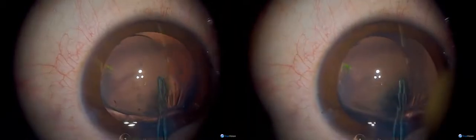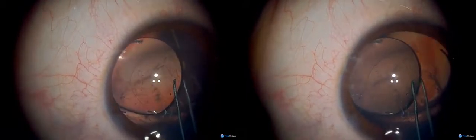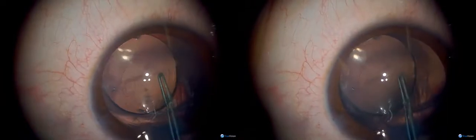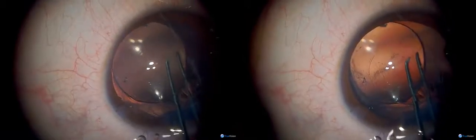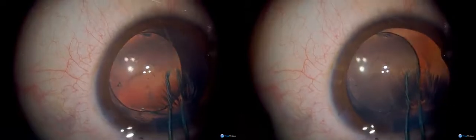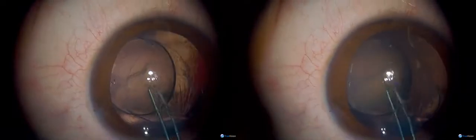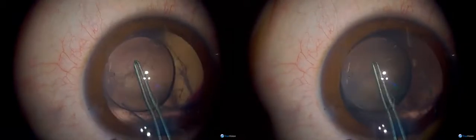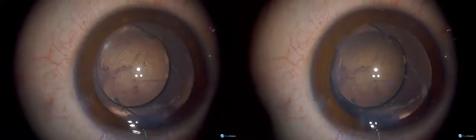So you're trying to remove the membrane under the IOL? Yes — I think this is the posterior capsule. I was going to do a primary posterior capsular rhexis, but he already has a hole in the capsule so I'm just making it bigger. Why not just leave the posterior capsular membrane and do a YAG laser later? You could — but if you leave the posterior capsule it will opacify at this age in all patients. If he's able to cooperate at the laser you could do that, but he wasn't very cooperative, so it's better to get it done now. He'd probably need a laser within a year. In an older child — eight or nine and cooperative — you can just do a YAG laser later.